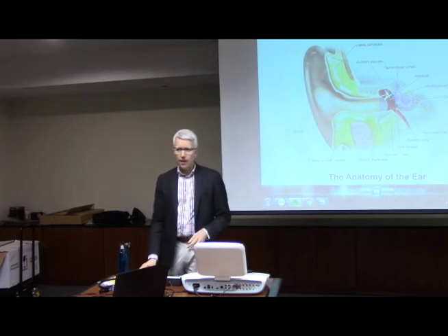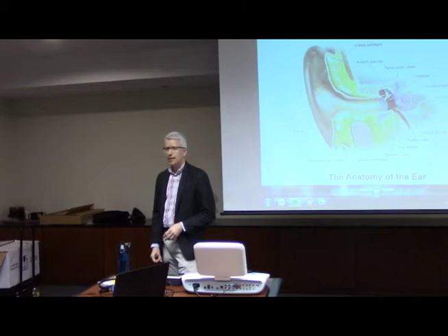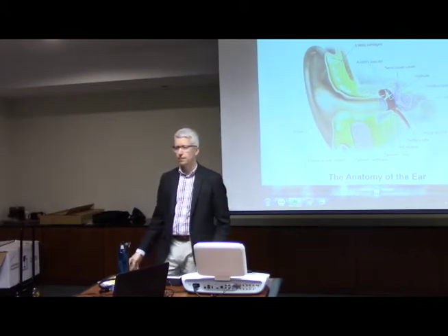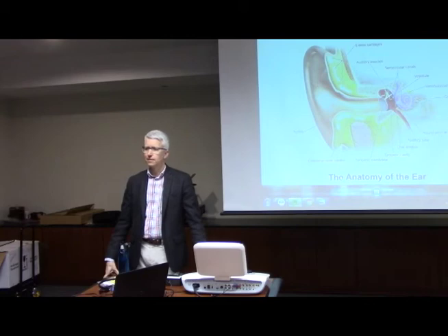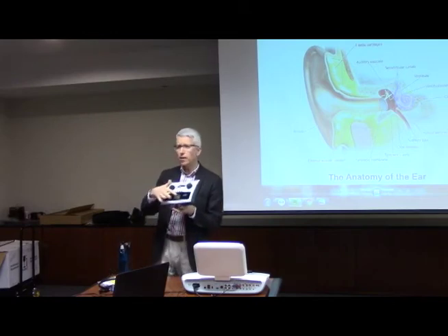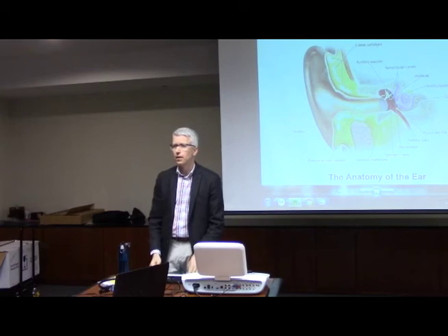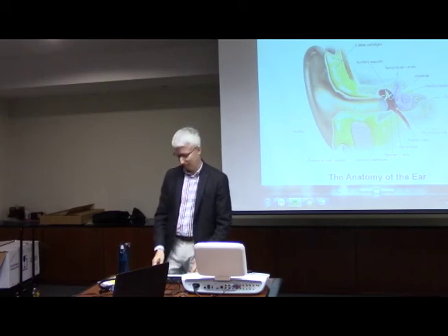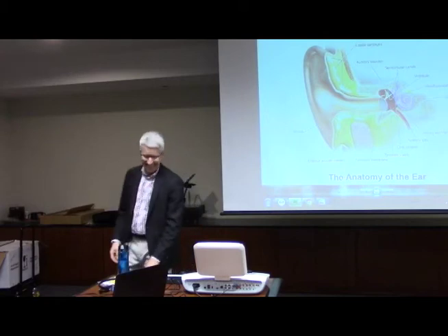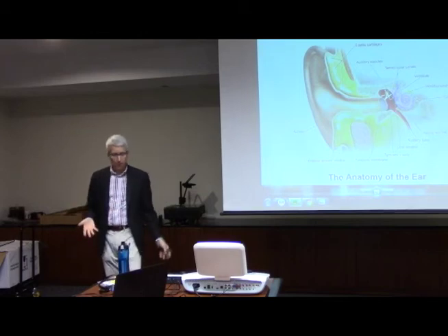And as the battery goes down, in the test, the testing is still accurate? Yes. The machine's really good about regulating voltage, so it knows if it's going down, and if it goes to a certain point, it'll just shut off. And it's really not too power intensive because if you think about it, right now it's showing a little display right here, and then every once in a while I'm going to present tones, so it really doesn't take a lot. So it lasts longer than your average child's toy. Absolutely, it does.